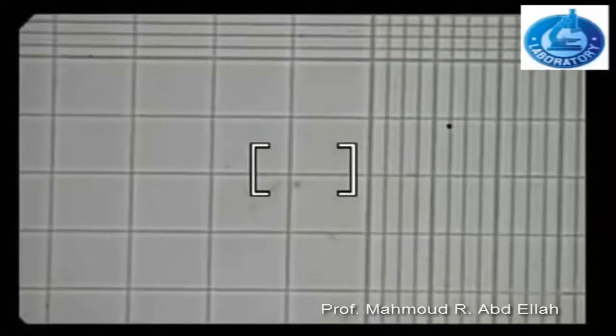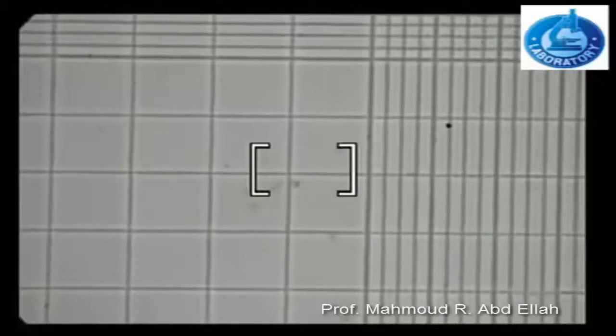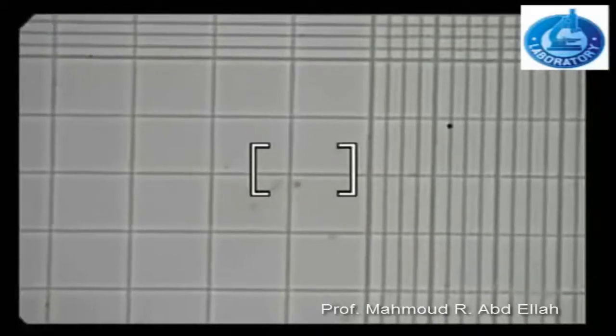Here at the corners of the large square, there are 4 squares that are used for counting the white blood cells. Every one of them is divided into 16 equal squares.